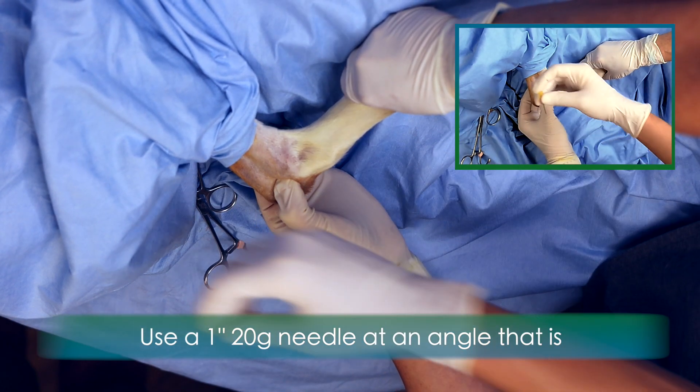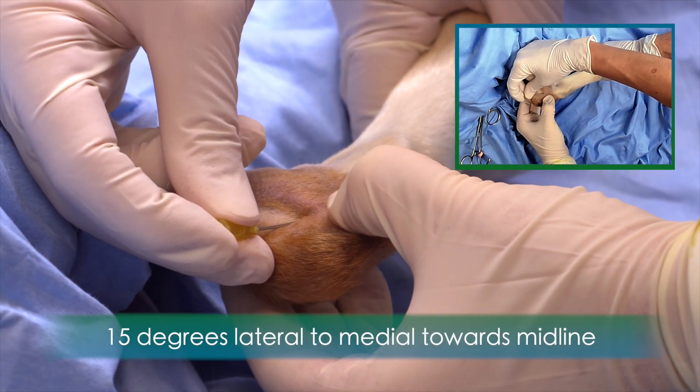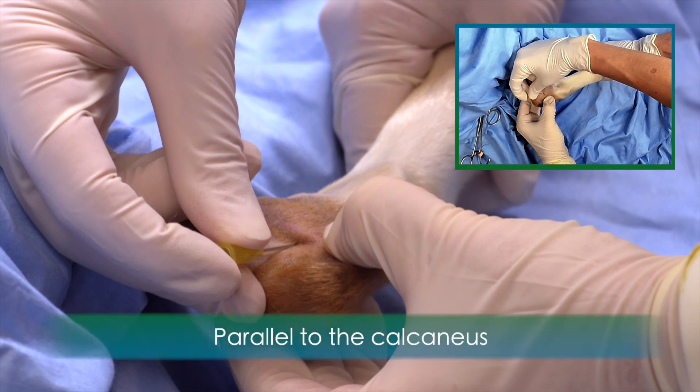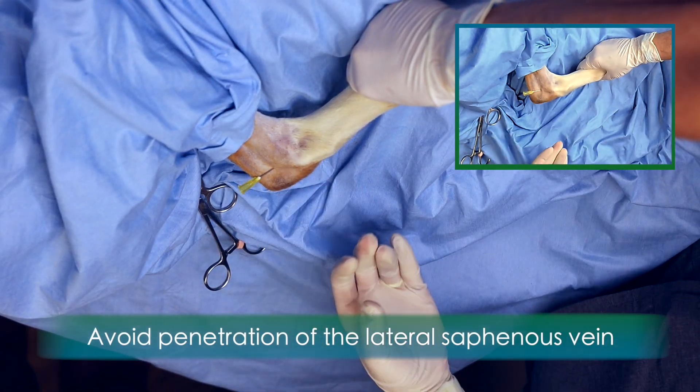Use a 1-inch, 20-gauge needle to penetrate the joint at an angle that is 15 degrees lateral to medial towards midline and parallel to the calcaneus. Avoid penetration of the lateral saphenous vein.